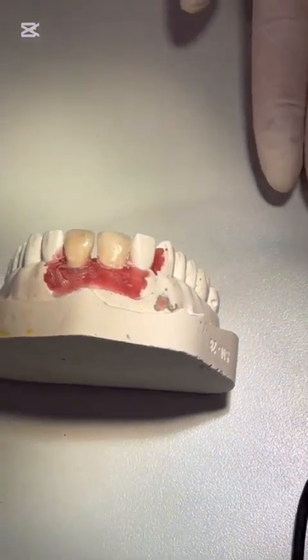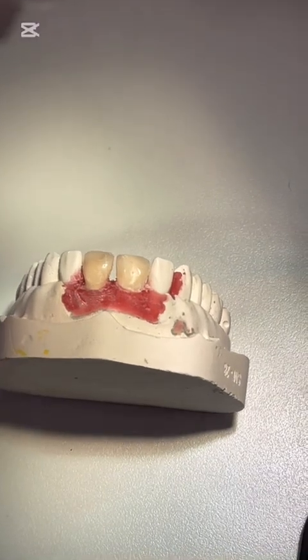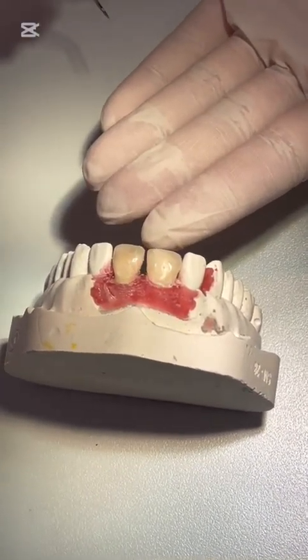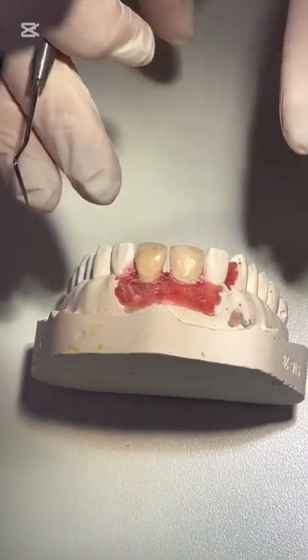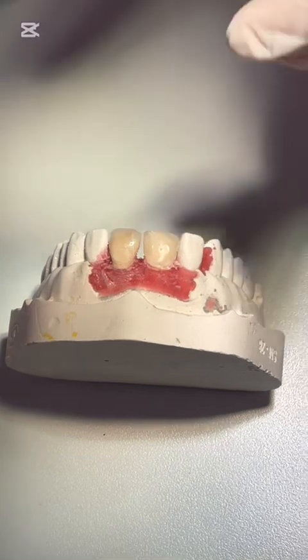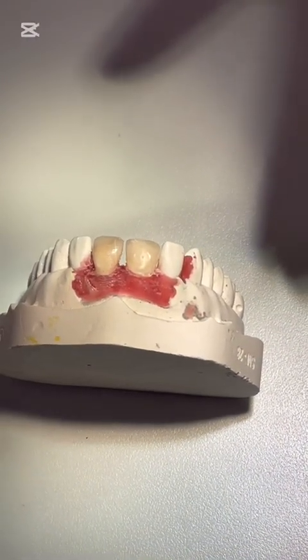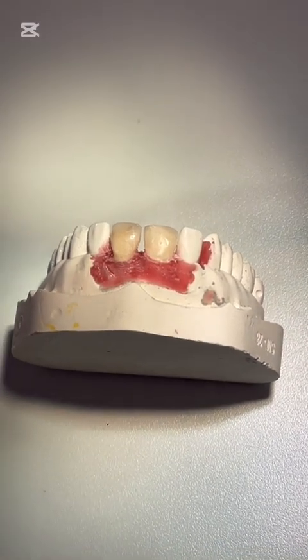How can I simulate? Simply by taking photos, using software programs, or sometimes by freehand mock-ups, like what I'm gonna do now, okay? Then you will present the results with the treatment procedures, with the approach, with the treatment plan to the patient, and then decide.